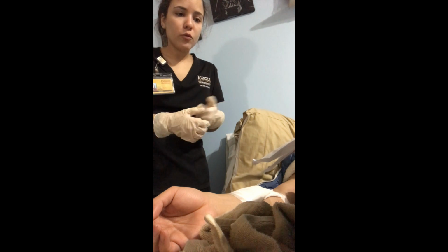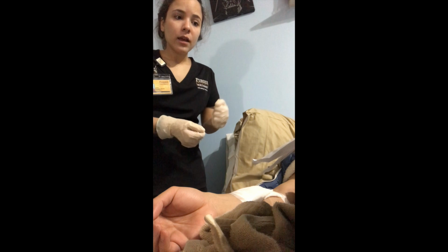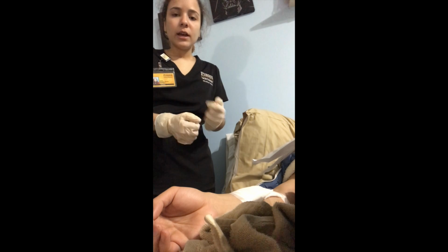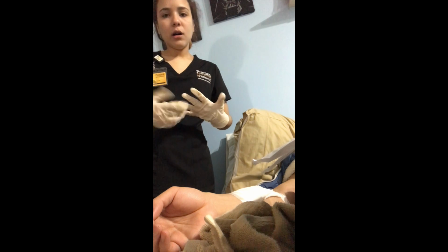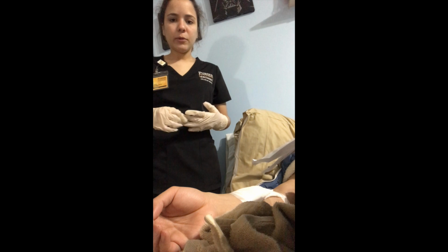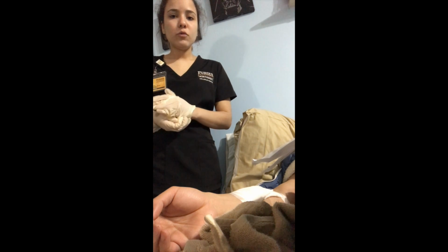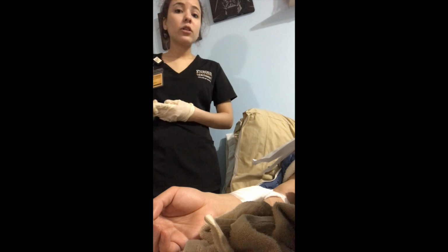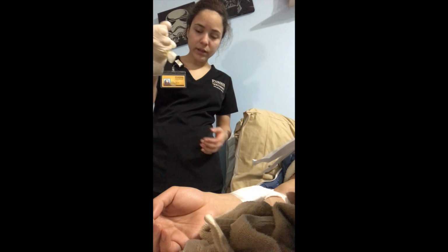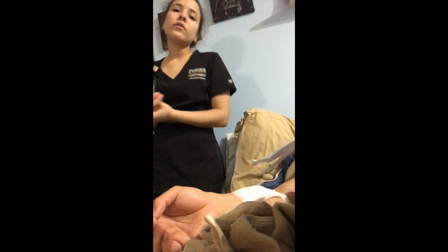And we need to remove all remaining equipment and place the patient in a comfortable position again. We can put the bed lower, and we finish applying the dressing, wound care and applying dressing. After we do this, we also need to remove our soiled gloves, making sure that you're holding them with your dominant hand, and put them below here, and you throw them away, and you clean everything else, and you can leave.